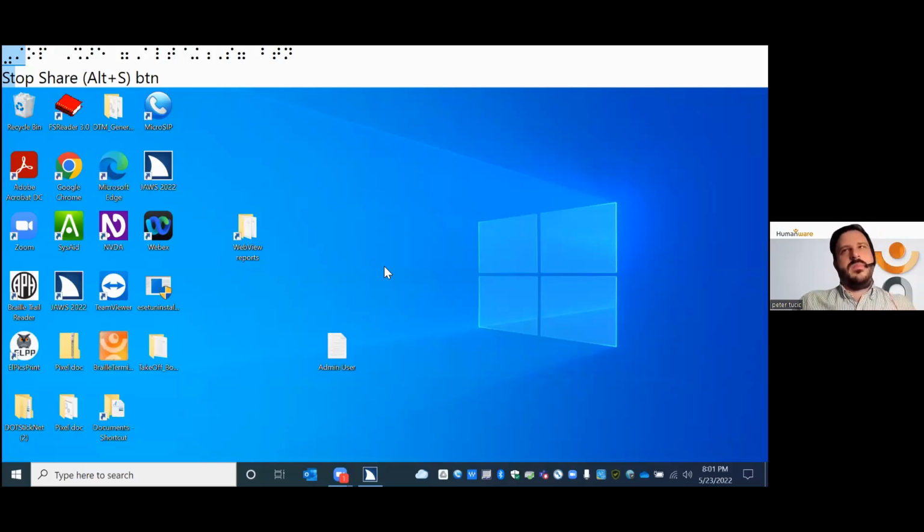So again, this is how you configure the language profile. And then in the speech settings is where you can say that you don't want it or do want it to speak your menus. I'm going to activate save configuration, and away we go. And now it's saved, and I'm back in business with my new English profile that has the content voice enabled in this case.